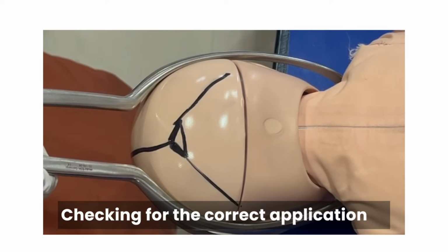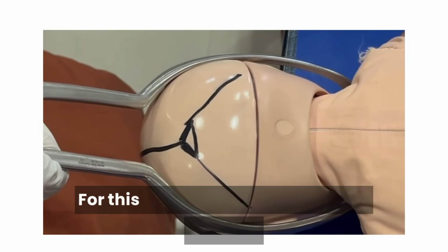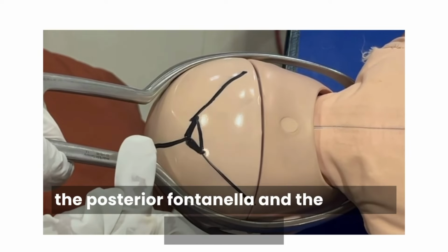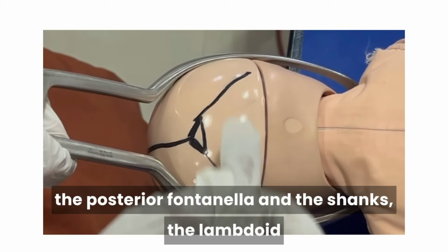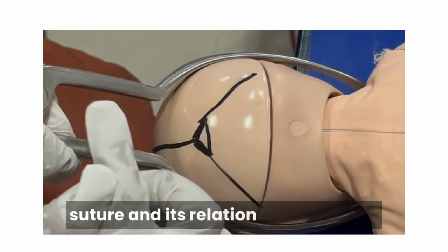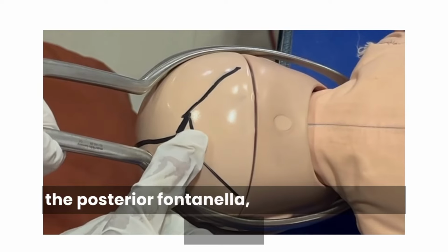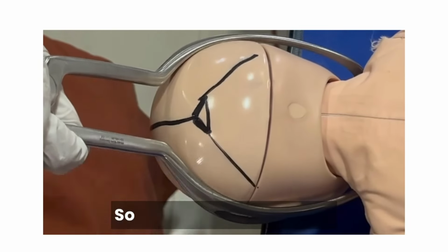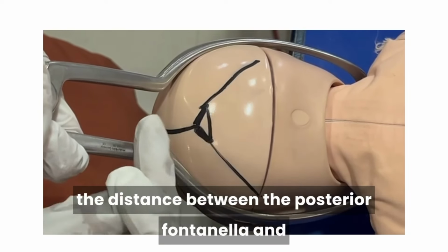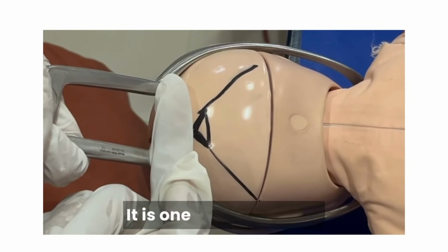Checking for the correct application of the forceps blades before giving traction. For this, I am using the relationship between the posterior fontanelle and the shanks, the lambdoid sutures and their relation with the blades, the sagittal suture and its relation to the shanks. So to go with the first structure, that is the posterior fontanelle, it should be in the midway. So it is in the midway, and the distance between the posterior fontanelle and the shanks should be 1 finger breadth. It is 1 finger breadth.